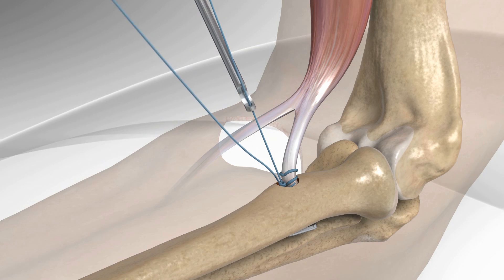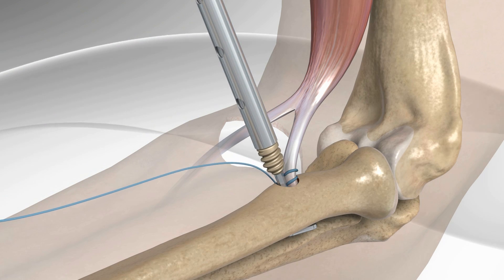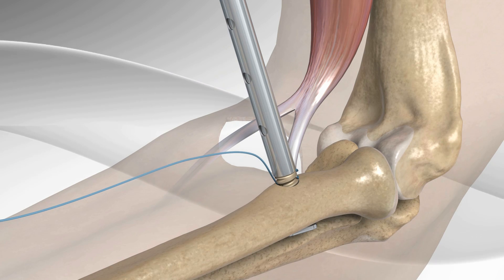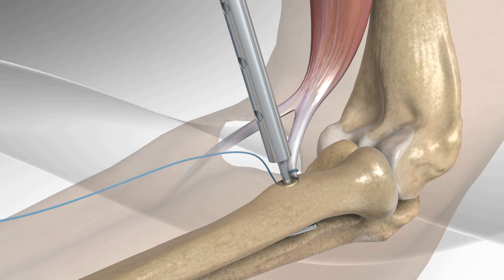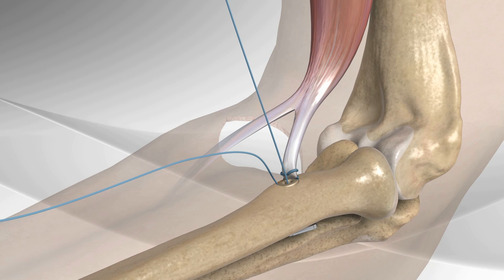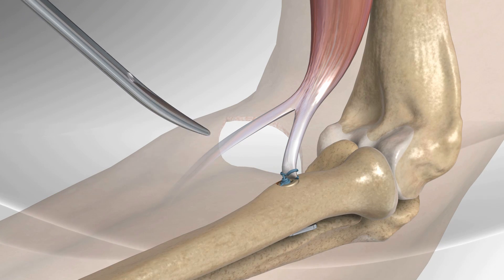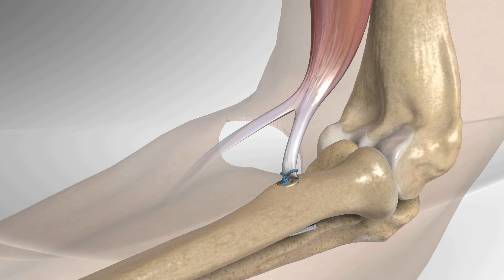A screw is inserted into the tunnel to help recreate the anatomical footprint and for added strength of the repair. A knot is tied over the screw and the remaining suture limbs are cut. The distal biceps tendon repair is now complete in an anatomical fashion.